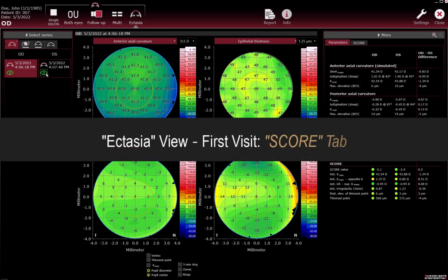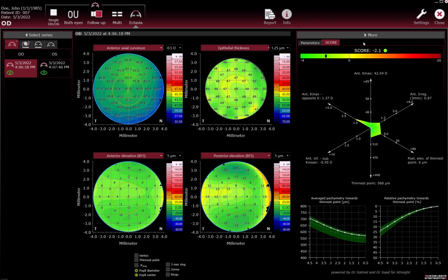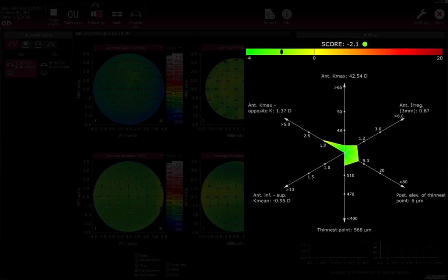Ectasia view first visit — Score tab. In the Score tab, review the measurements and parameters. The score value is calculated from the shown parameters that are suspected to be discriminant topographic indices for ectatic changes in the cornea. The score bar visually locates the score value on a colour scale bar with a value range from minus 4 to 20. The black oval symbol on the score bar indicates the position of the score value.